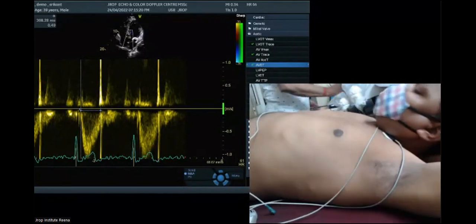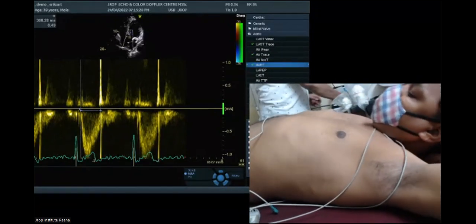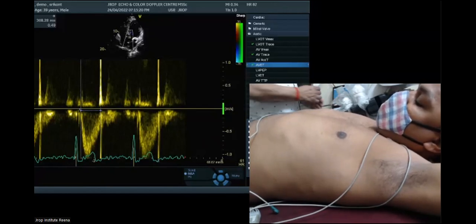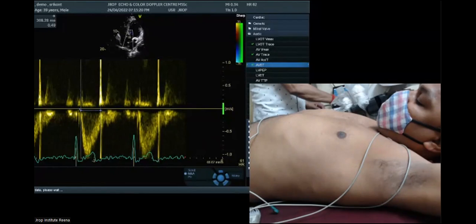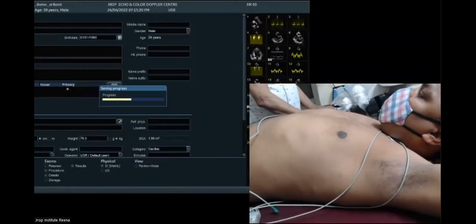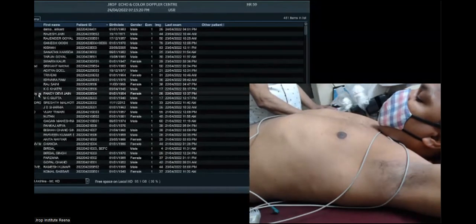And sir, you asked me to remind you about DP and DP by DT. DP and DT, okay. Let me just look at the mitral regurgitation. I'll show you what DP/DT is.